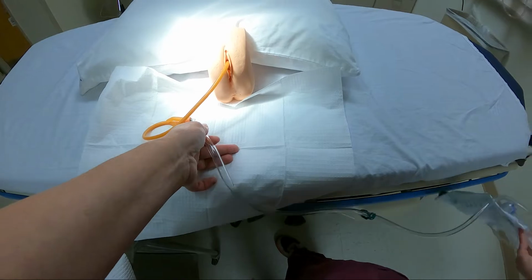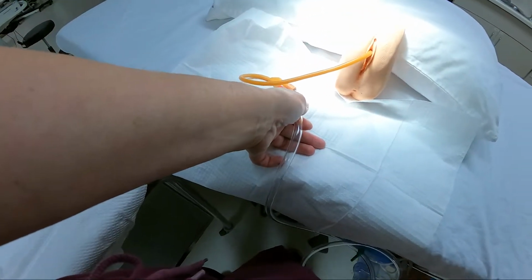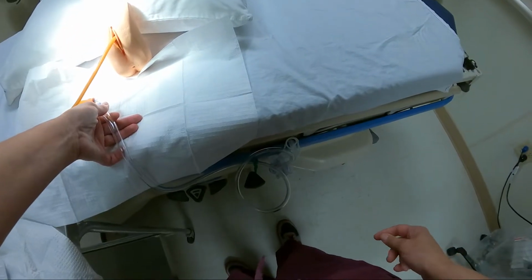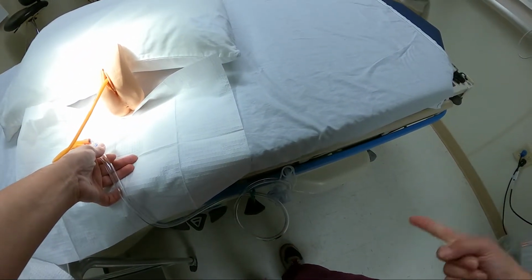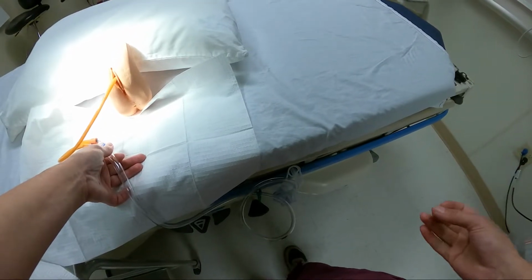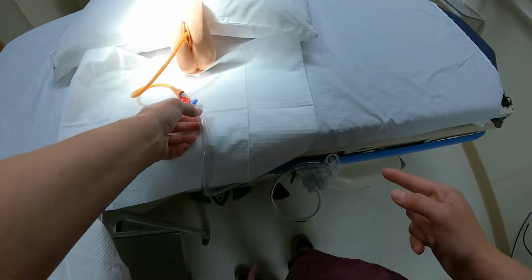So it needs to be draining, which means gravity. Make sure that wherever you're putting this bag, it's hung up on an area that isn't going to get ripped out, and don't lay it on the floor. So it can't be on the floor, you don't lay it on the bed, and you need to have it hung nicely on the side of the bed.